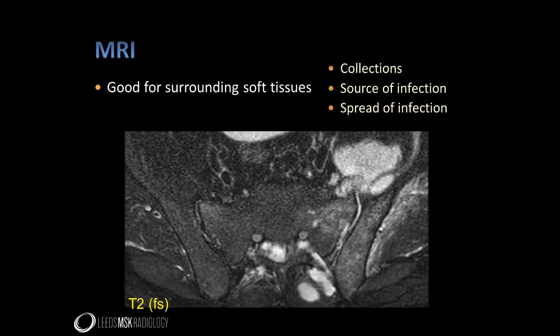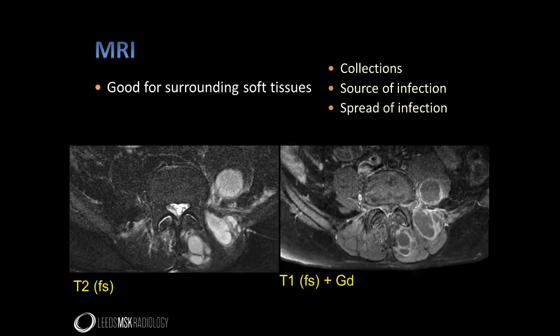This is the case of infective sacroiliitis shown previously. In addition to the joint effusion and bone and soft tissue oedema, we can appreciate periarticular collections both anterior and posterior to the joint. MRI is excellent for showing this periarticular extension of the disease and may also show the source of infection if it has spread from periarticular disease. On a slightly more superior slice, we can see extension of the collection into the psoas and paravertebral musculature, shown with thick enhancing walls on the post-contrast imaging.